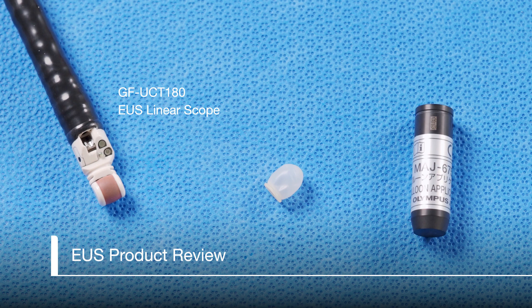Let's review a few features of the tip of the GF UCT 180 EUS linear scope. The salmon colored band is the transducer. There are finely cut crystals under this band and this area in particular should be handled with care. Here we can see the balloon attachment groove. Note also the water and suction ports. The linear balloon, part number MAJ 249, has one ring. The linear balloon applicator, MAJ 675, has one hole, the same as the balloon.